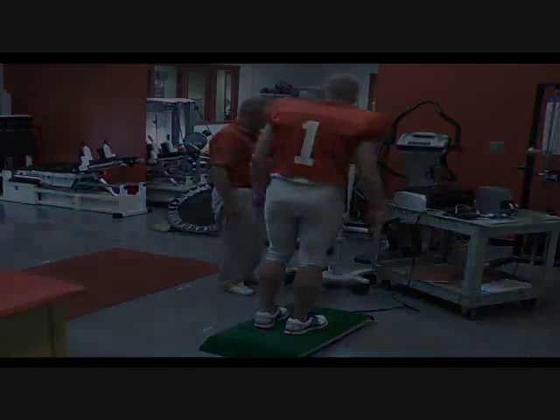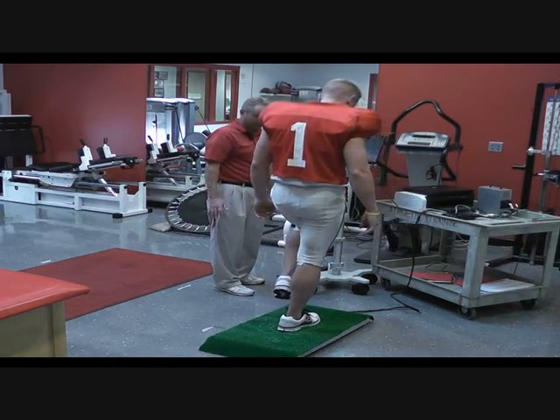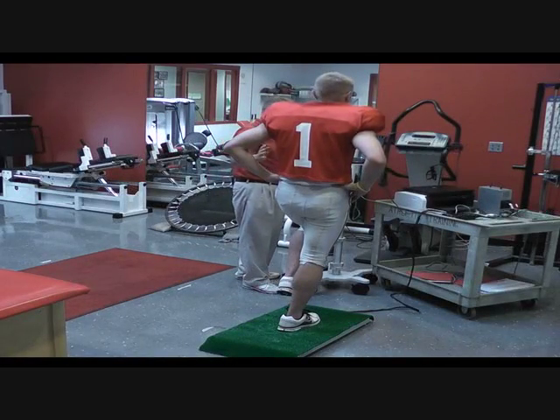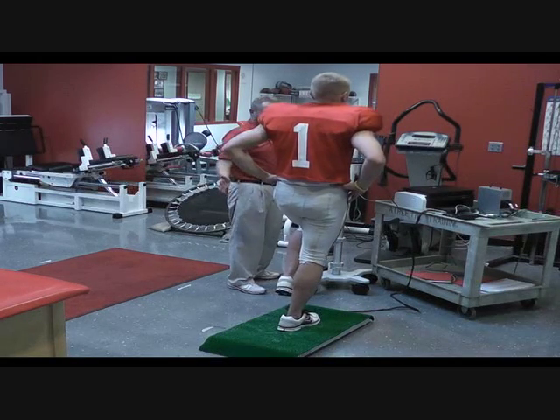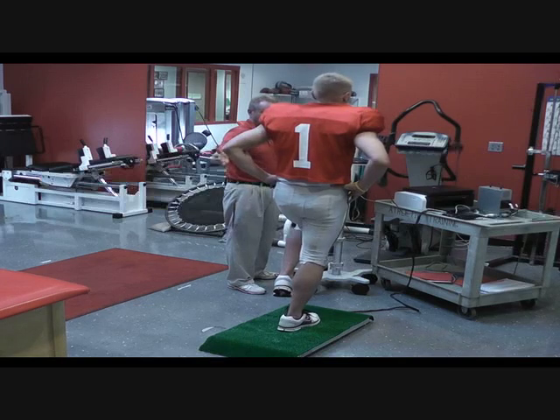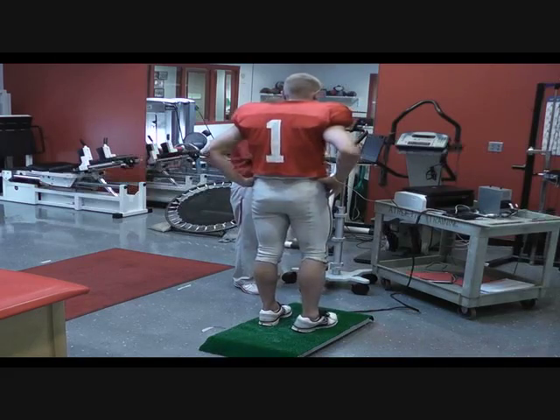We're going to do two more. You're going to stand on your right foot only, with your left foot up in the air. Get your balance, hands on your hips, then close your eyes. We're going to stand as still as you can, and the computer will count for 20 seconds. Begin. The computer is recording any movement — forward, back, right to left. And then we're able to look at this: if you have a head injury in the future, we could compare it to see if your balance has changed. Open your eyes.